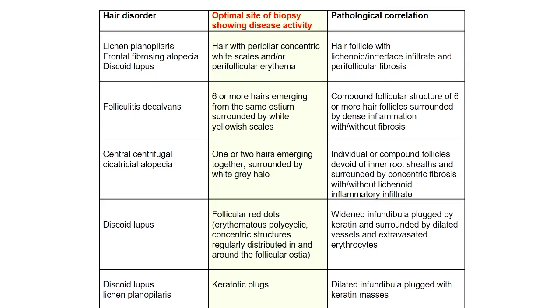So try to pick up an area with peripilar casts.